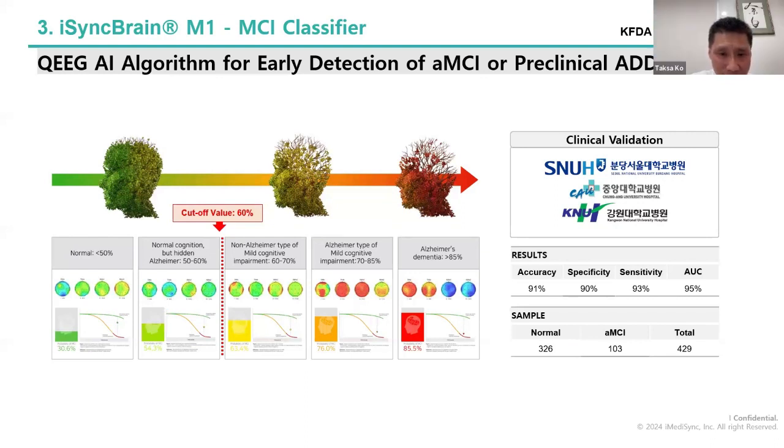Yes. Sometimes I see 75 or, for instance, 76% probability. At that moment, I must explain to that person, you may have MCI, and you may not have MCI. Every time I'm very worried about that explanation. So I understand that.